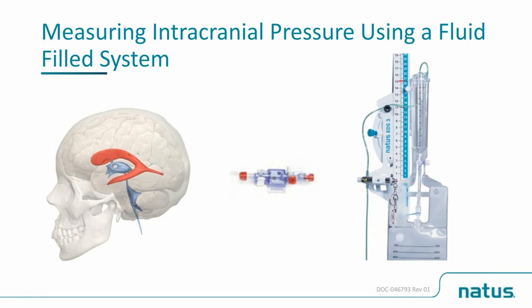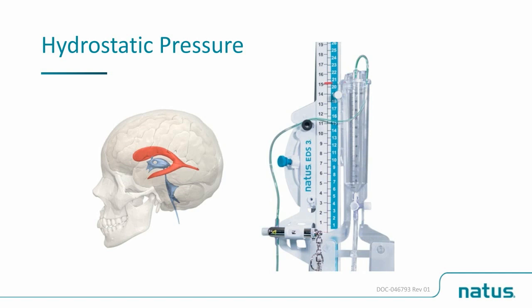Because of this, there needs to be an active fluid column, meaning drainage from the ventricular catheter into the drainage system. No drainage, no pressure, no ICP reading. This is why it's important to make sure your catheter is patent and to notify the provider if occluded. Before we talk about leveling and setting the pressure level, it helps to have an understanding of how this works.